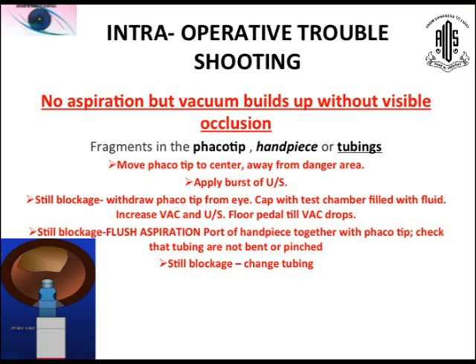Move the phaco tip to the center, away from the danger area, and apply a burst of ultrasound. Since you know burst ultrasound, I presume you know what I am asking you to do.